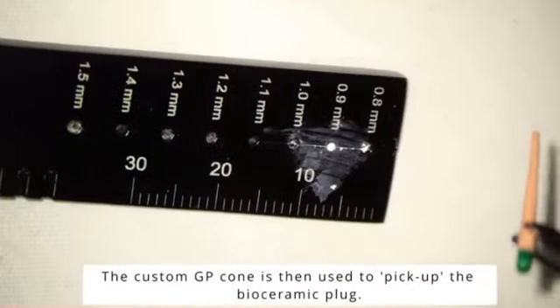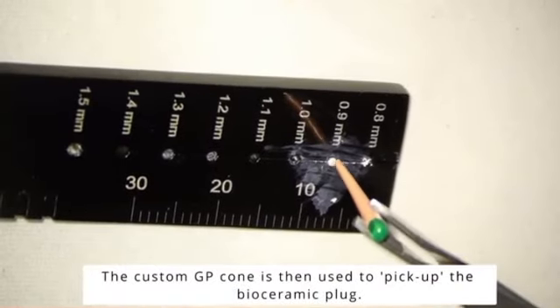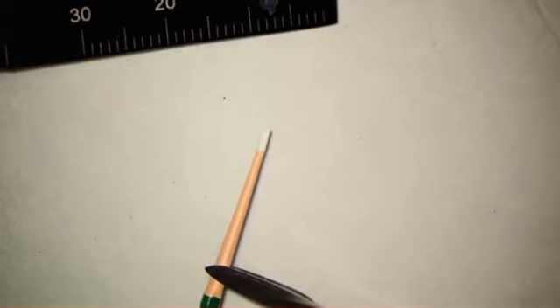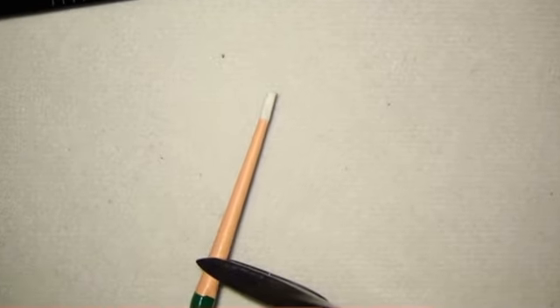Then the custom GP point is used to pick up this pellet, and it's almost beautiful to see. Notice what we have now.